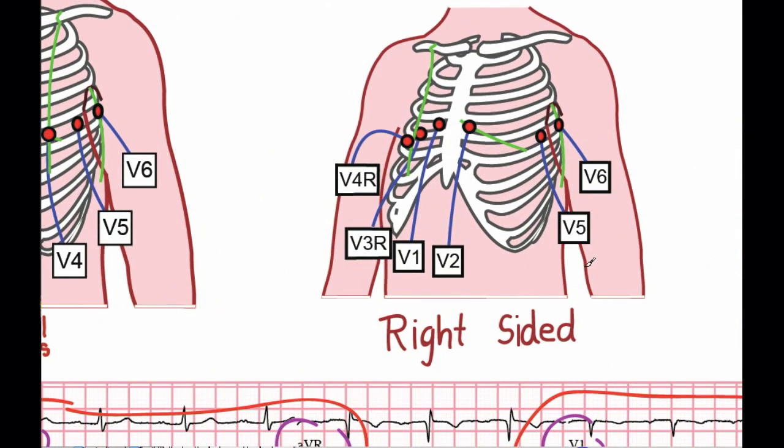Right-sided electrodes would go in the corresponding position that V3 through V6 do, except on the right side, instead of the left. This is useful in diagnosing myocardial infarctions on the right side of the heart. V1 goes in the exact same place as you had before, and so does V2. V3 is placed in the same spot you had on the left, but this time on the right.